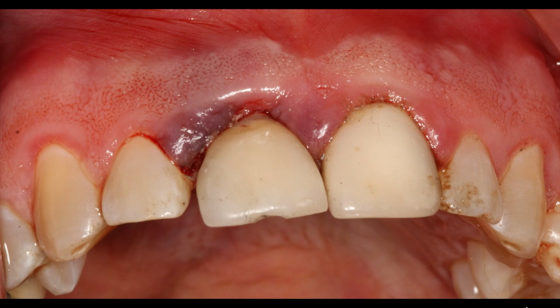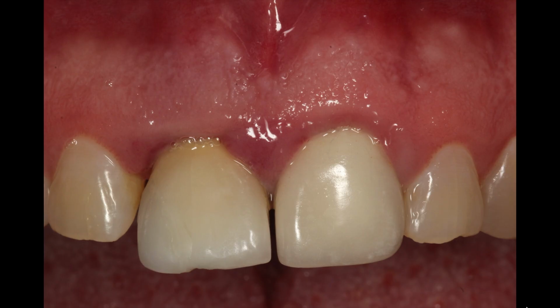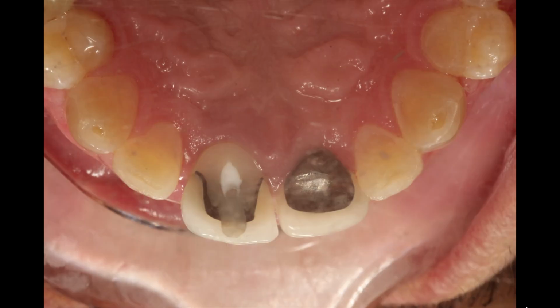All right, so a week later, this is what this patient's going to look like. Looking quite a bit better. You see how the papilla are still there? That's why you take the risk of dealing with the infection. This is the one place that I'll do this because it's worth it to keep the papilla there in the maxillary anterior. And again, there's the palatal.